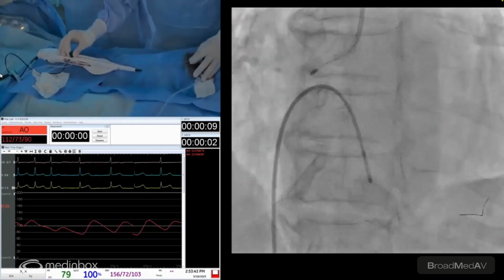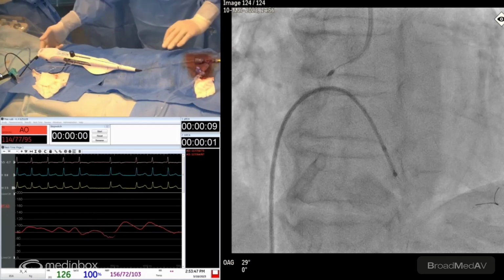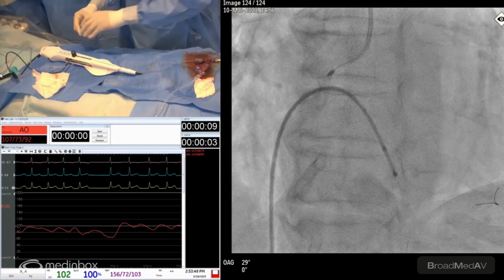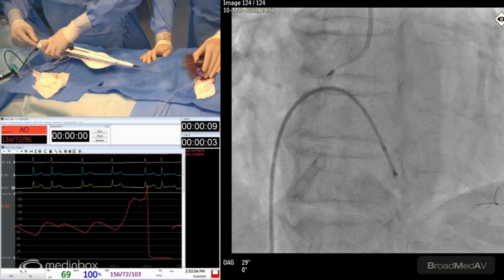Very smooth. There you go. We're all smooth. Very good. The sound is stable. Now it's fine. Yeah. So let's get out of here. Down a glide.